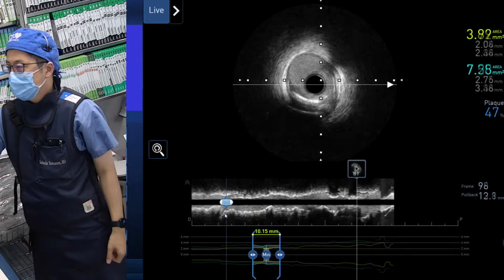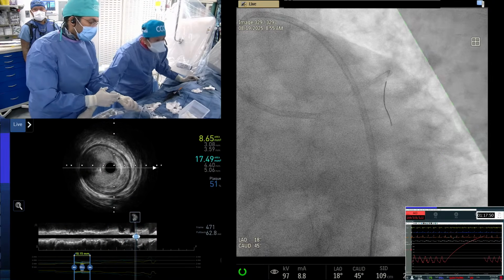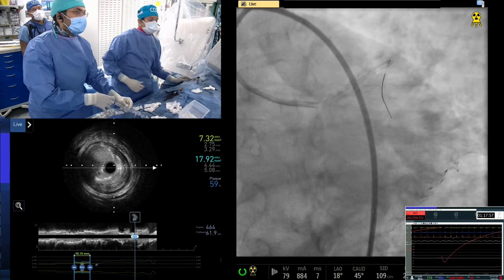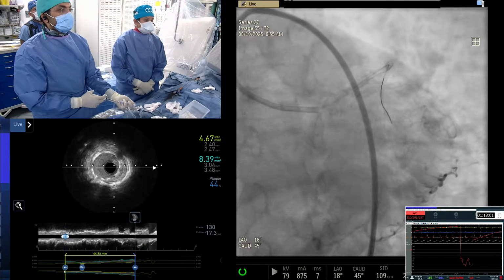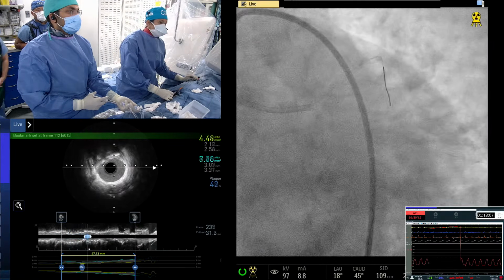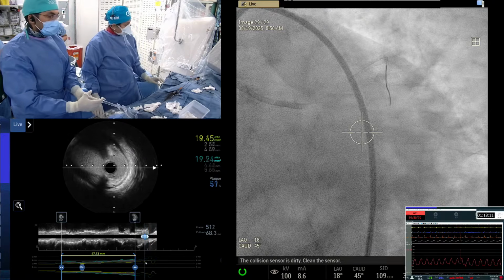Kiski, next level imaging. Ready? Absolutely fantastic. Look at that. Beautiful. Proximal edge is nice. Yeah, EKG is good. Other than imaging, left main looks good. Okay, let's go low mag and be done with it.